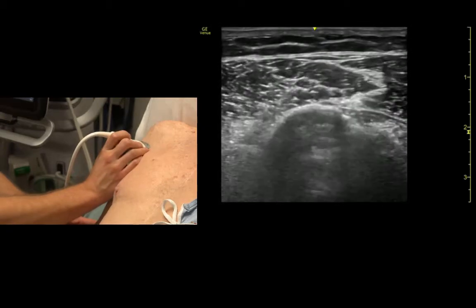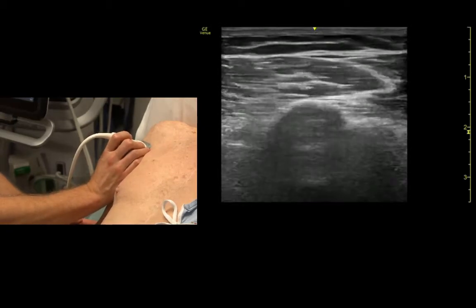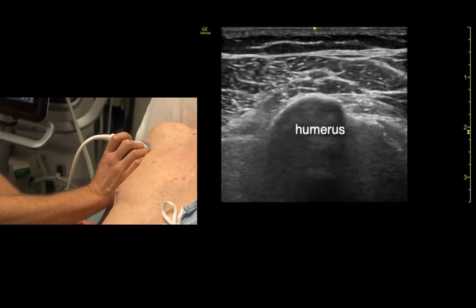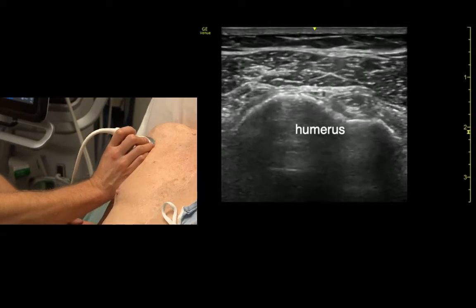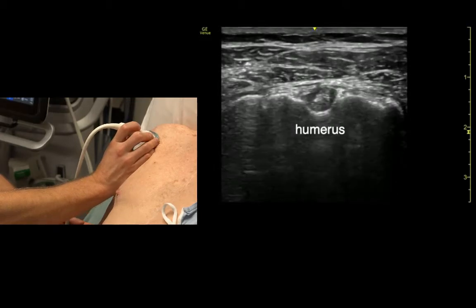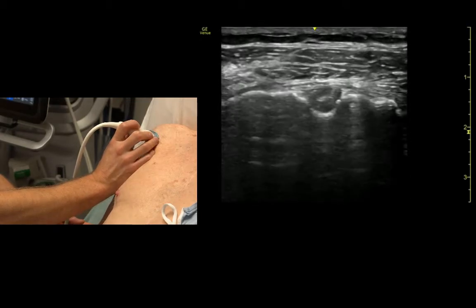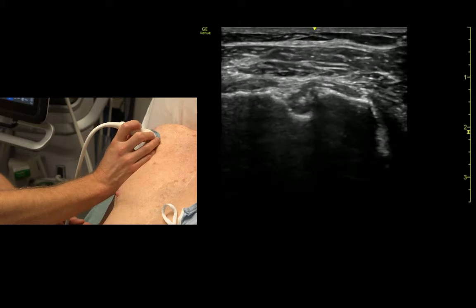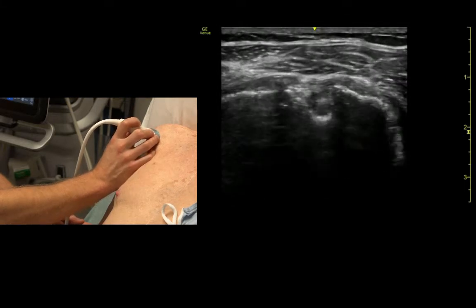What I like to do is start here on the humerus, identify the humerus in the upper arm and slide my way up. As we slide up the arm we identify the bicipital groove, and then the bicipital tendon sits right in it.